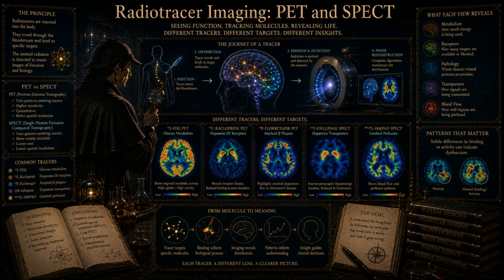You have identified the primary physical limitation of SPECT straight away. Because we lack the elegance of coincidence detection, SPECT must rely on brute force physical engineering. We use collimators. Right, the text describes these as massive blocks of lead. Imagine a thick, incredibly heavy block of lead attached directly to the front face of the detectors. This lead block is riddled with thousands of perfectly parallel microscopic channels. So it's like looking through a dense bundle of completely straight drinking straws. That is an apt visual, yeah.